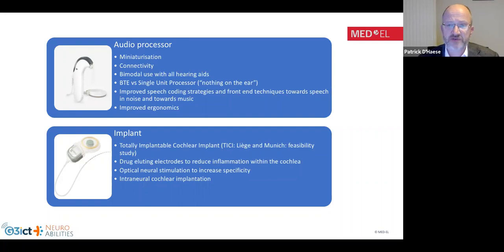Now, a big challenge for cochlear implants is definitely speech in noise, so understanding speech in noise, and music perception, music appreciation, and one of the following speakers will also talk about music. Now, innovation will happen in this field and is already happening. How to further advance that, how to further improve that, so that people can also understand really well, for example, in noise. And obviously, improved ergonomics is something that comes by means of innovation, which is a continuous process.